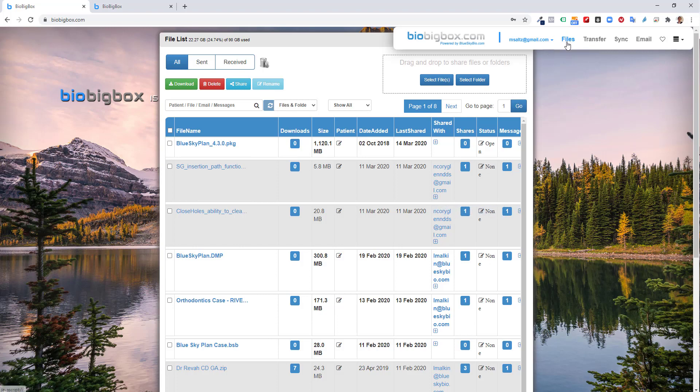On the top, you can see we have the capability to upload and transfer files. You could sync and backup files from your computer, or sync them and then share them easily. And we also have HIPAA-compliant email functionality.